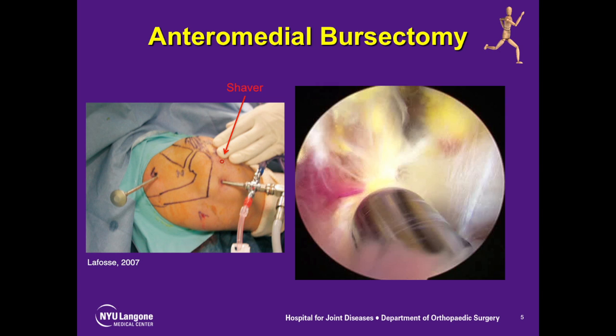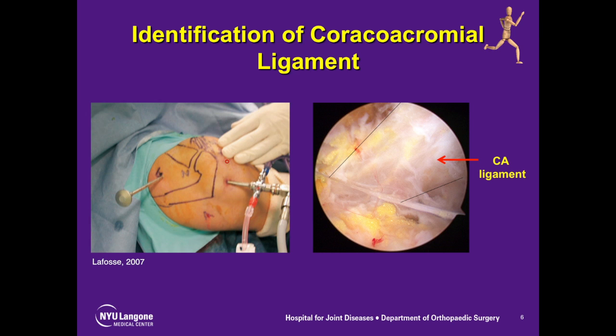We utilize the standard posterior portal for intra-articular inspection. Once this is complete, the scope is then placed into the subacromial space through a lateral portal, and a shaver is placed in the anterolateral portal and a bursectomy is performed. This is done to allow visualization of the CA ligament, or the coracoacromial ligament.